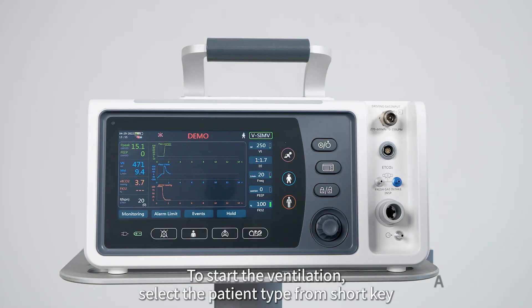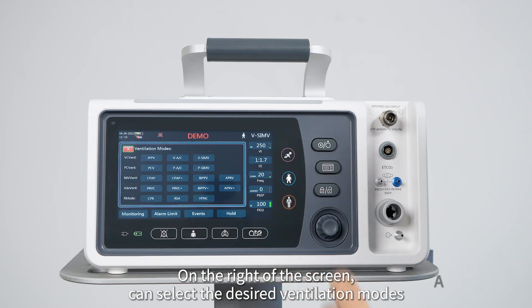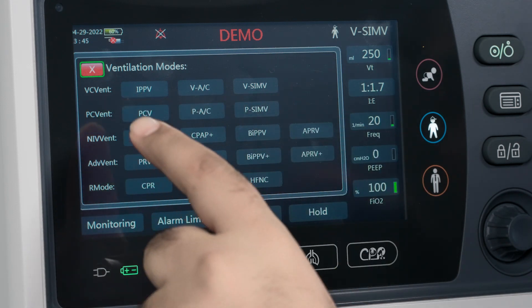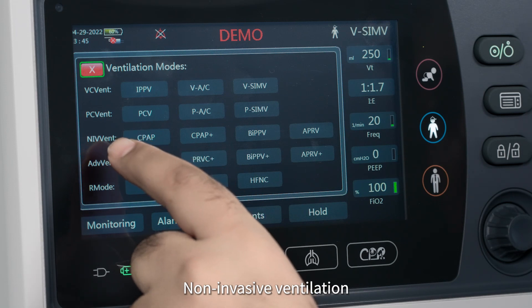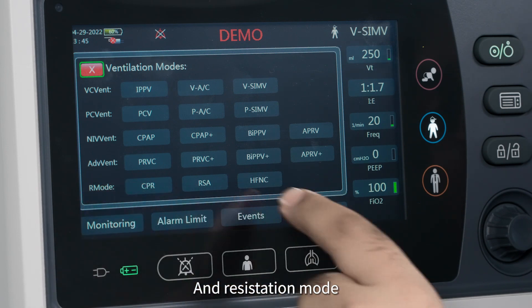To start the ventilation, select the patient type from the shortcut key. On the top you can select the desired ventilation modes. Available modes include volume control ventilation, pressure control ventilation, non-invasive ventilation, advanced ventilation, and resuscitation mode.